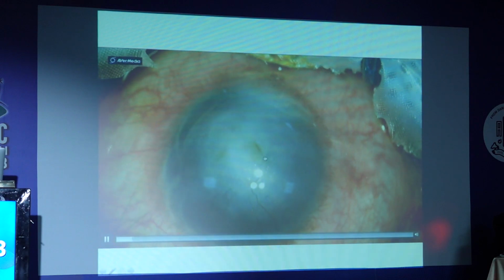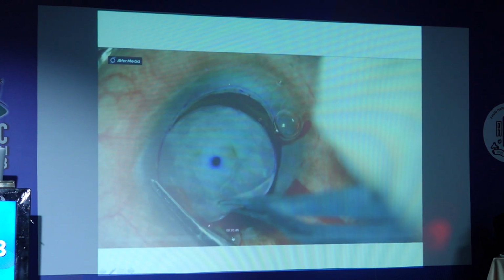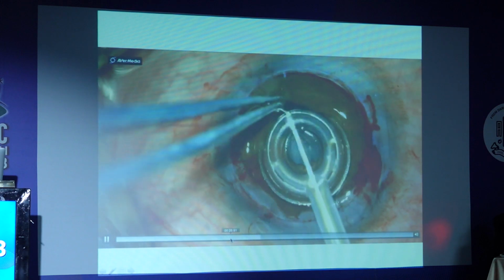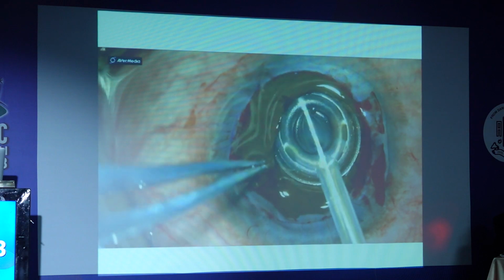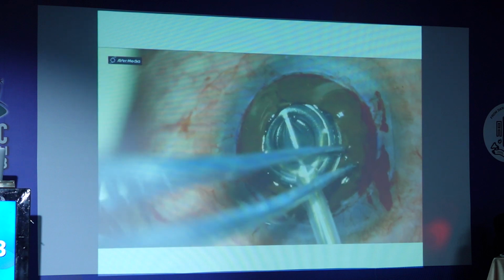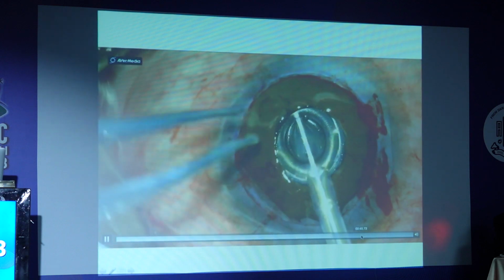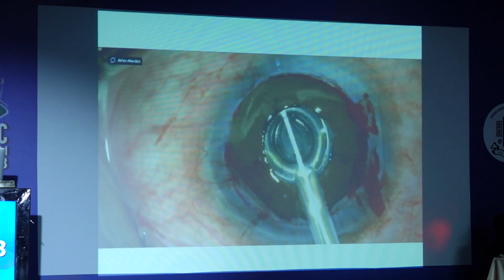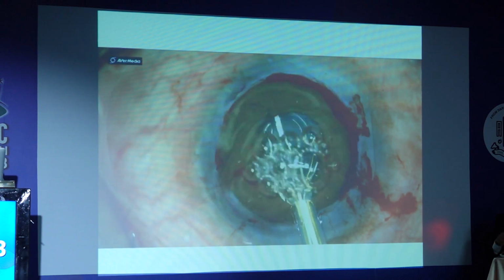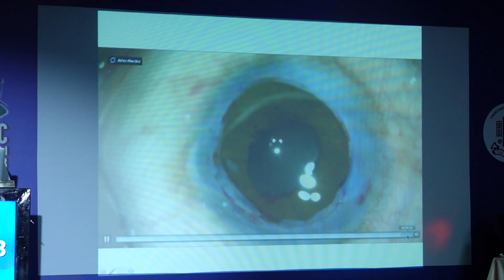You can see there is a dense vascularization with a scar, and once I remove the cornea here, it was a non-dilating pupil. So gently you have to lift the iris, place this Zepto device under the iris, and once it is secured on the lens, centered, then just press the button, and the rhexis is done. So without visualization also you can do the rhexis in these cases. So Zepto helps a lot in such scenarios.